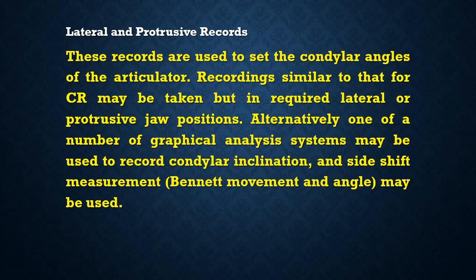Well, the lateral and protrusive record could be transferred by using waxes or interocclusal records from the patient's mouth, or it could be transferred by using a more complicated method, as I say, the graphic tracing or pantographic tracing.